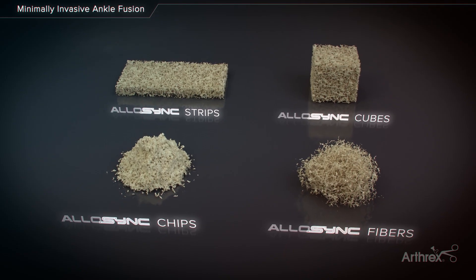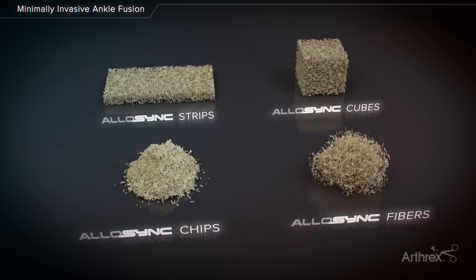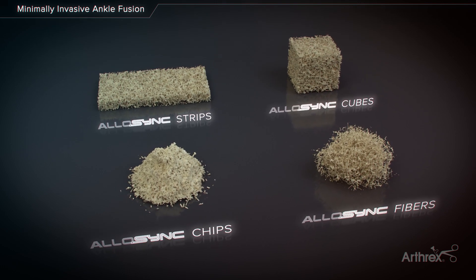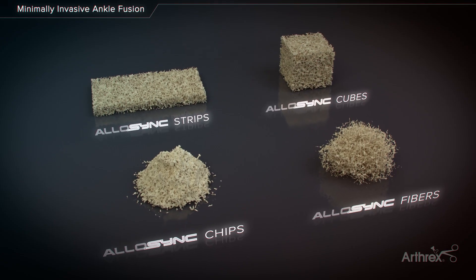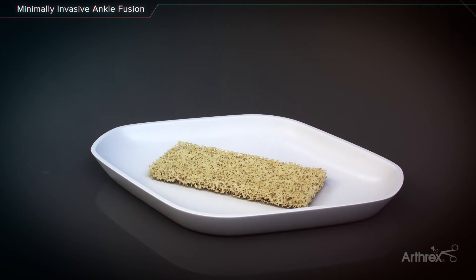Ankle fusions may benefit from the addition of an allogenic demineralized bone matrix, or DBM. AlloSync demineralized sponges and fibers are available in various shapes and sizes, including cancellous strips, cubes, chips, or cortical fibers.